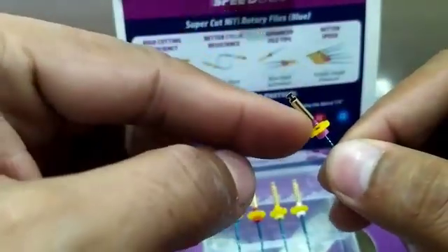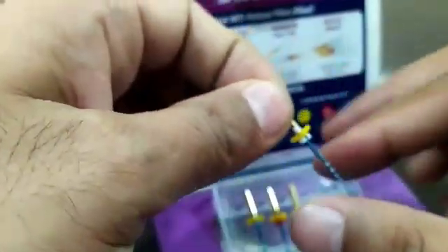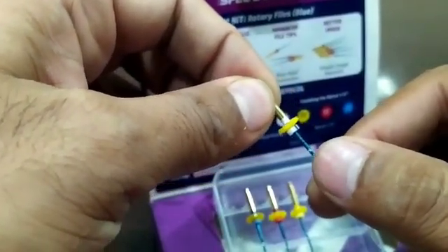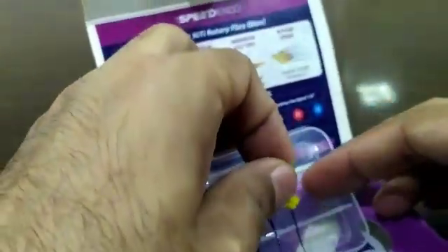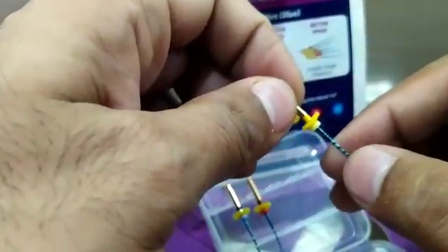The next file is S2, which has a white band on it. S2 is specially for the middle part of the canal. All the files should be used till the apex — they are designed so that each prepares a specific part of the canal.